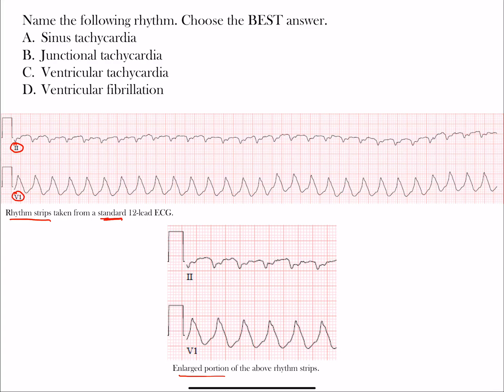Why don't you take a moment, pause the video, and then restart it when you've come up with an answer. Hopefully you've had a moment to go through it and make a choice here. Let's look at each one of these. Notice that the first three choices - sinus tachycardia, junctional tachycardia, and ventricular tachycardia - all have tachycardia.